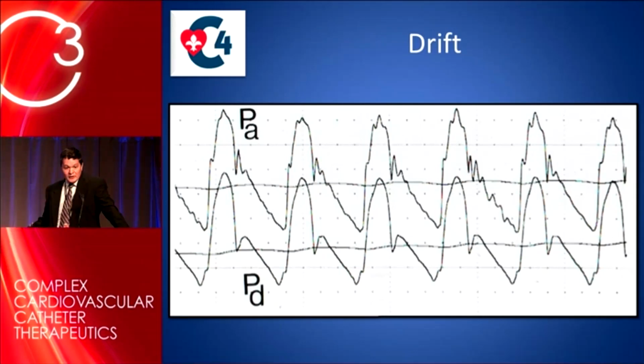There are hemodynamic gremlins which exist in all of our catheterization labs. They have gotten better, they have gotten more tame, but they still exist. When we see pressure ratios that look like this, as we put the pressure wire down the coronary artery, we introduce hyperemia and we measure. We have to always not just take the fractional flow reserve measurement which exists on the screen, and in this one it would be highly significant.